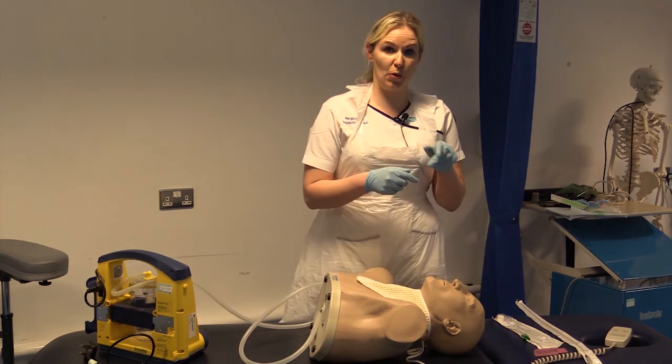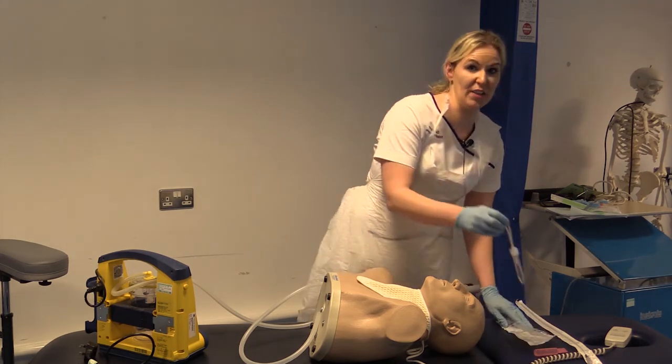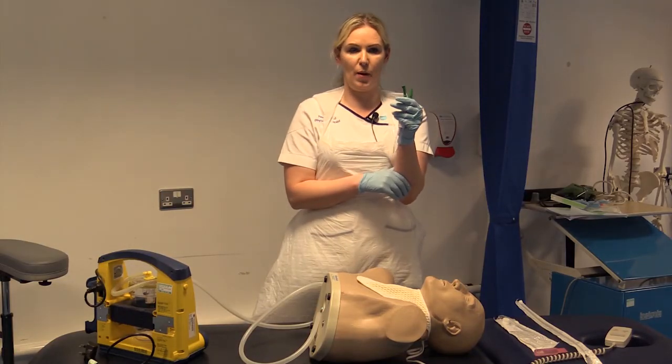Okay, so this is just a short video to show you how to attach a sputum trap to your suction if a sample is requested. Okay, it's very easy and straightforward, but it is worthwhile any time before you go in to do a suction on a patient that you check with the medics if a sputum sample is requested.